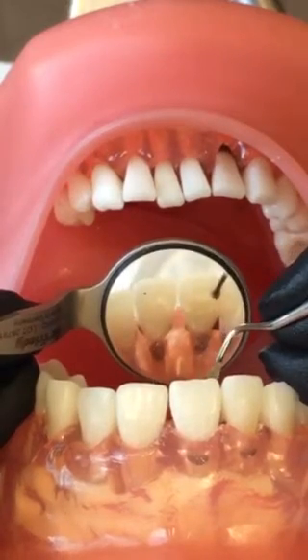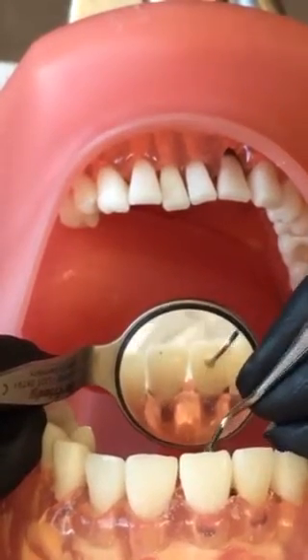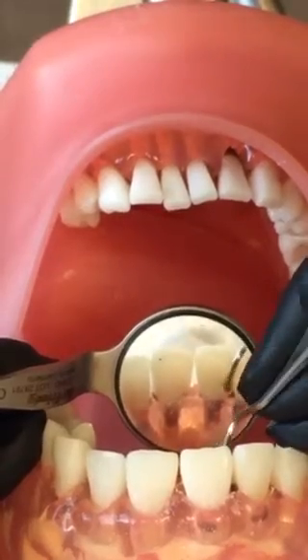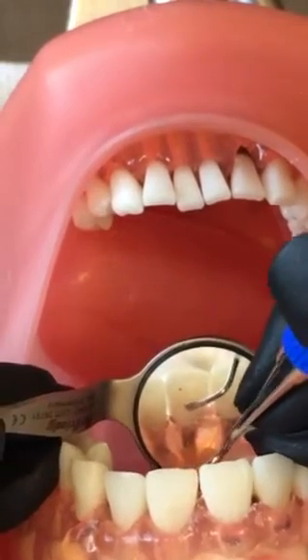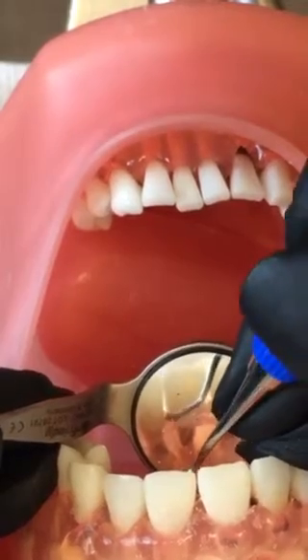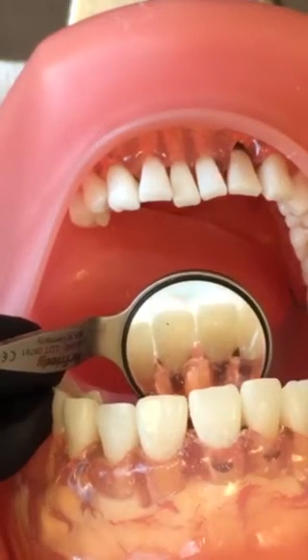So if these teeth had stain, if this was a smoking patient, you get right under the deposit and basically just scoop it right off. Or you can use the lateral borders — great for supragingival calculus removal on the anterior linguals and stain removal. That is your Neve 1 scaler.